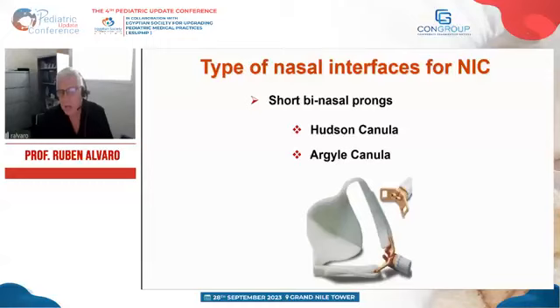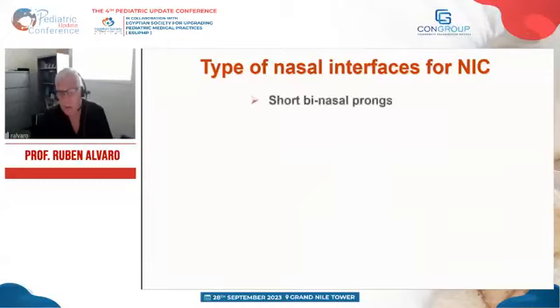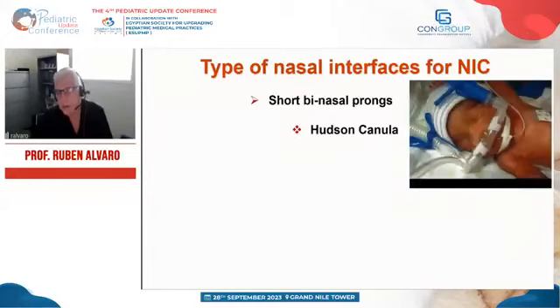We have the Hudson cannula that is very bulky, very stiff. It's very hard to keep in place. The nurses hate these prongs. And we used to have these prongs in the unit. We don't have them anymore.